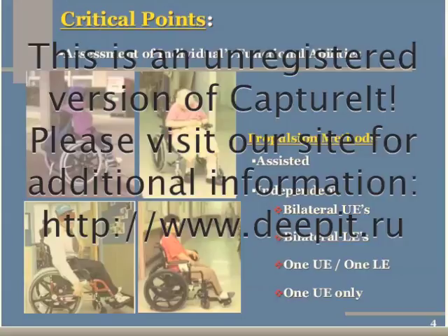This may not sound impossible, but try it yourself, just like we recommended that you sit on the seat cushions to understand them better as well. You will likely notice that manipulating 2 rims simultaneously is a very thought-laden process. You really need to think about what you are doing and have the motor ability to do it. You can imagine that it is very important that when this is considered as a key feature of the mobility base for the person, that the person have the opportunity to try it during evaluation before it is recommended or purchased for the person.